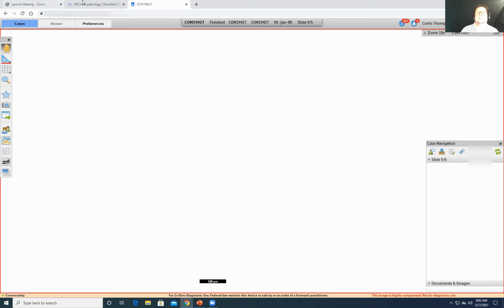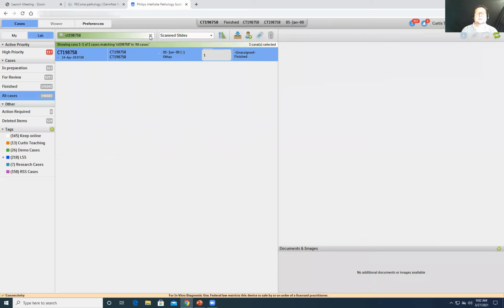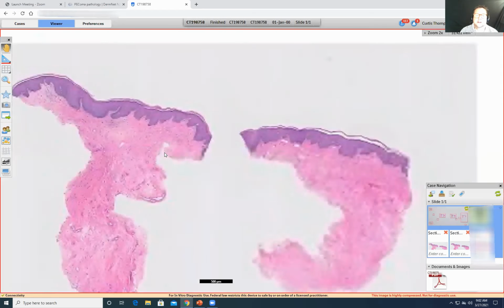So next case, number 5. Let me see if I can model. Yeah, we should pull all these up at once. We can rescan them and put them in an unknown set, but I didn't do that for this.